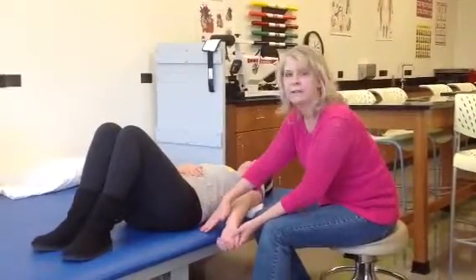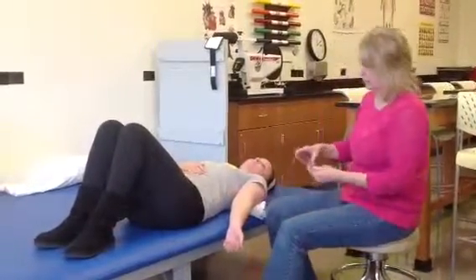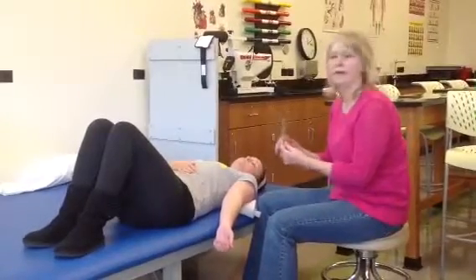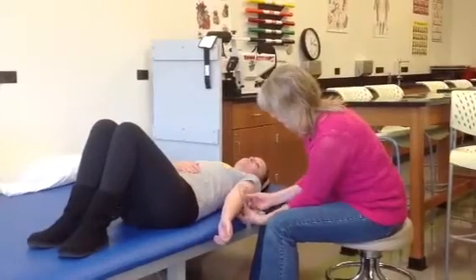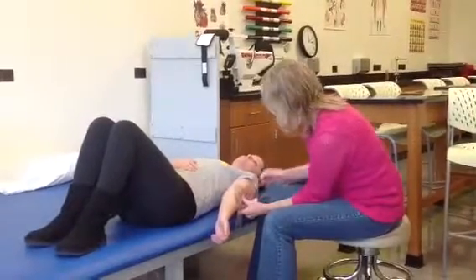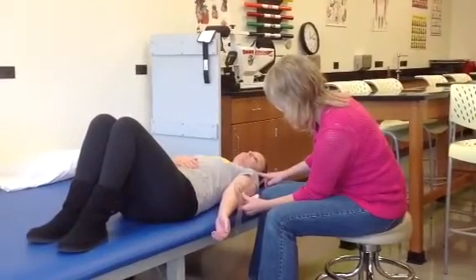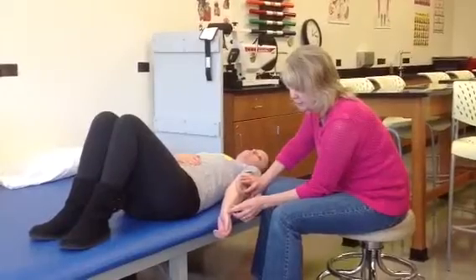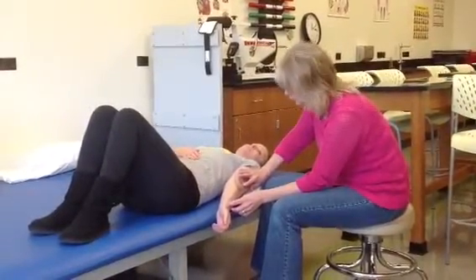If we had her against the table, her hand might not be able to go further down than it might go. We'll start with our goniometer by putting the axis on the lateral epicondyle of the humerus, and then we're just going to line up the other end with her acromion process right here, and then we're going to put the movable arm at the styloid process of her radial bone here.